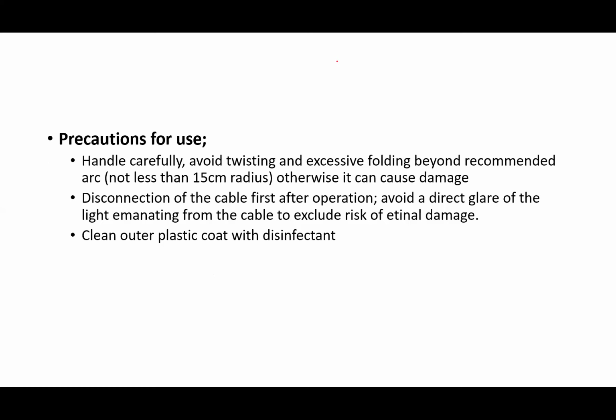Sometimes you go to the theater and you just see the cable hanging on the light source and having some form of twist. So in those situations, it is destroying the fiber optic material inside the cable, okay?